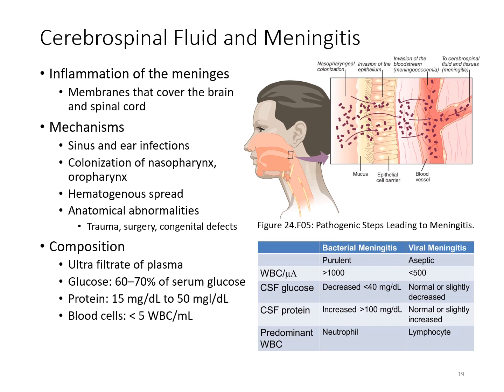And then, of course, if you're doing a cell count in hematology, if you see the presence of blood cells, that's going to indicate that the tap is traumatic or there's some other hemorrhagic type of issue going on. If you're seeing a lot of white blood cells, then that's going to indicate that there's an infection. A fewer number could mean that there's a viral infection. Seeing a presence of neutrophils versus lymphocytes is also going to aid in determining if it's bacterial versus viral.